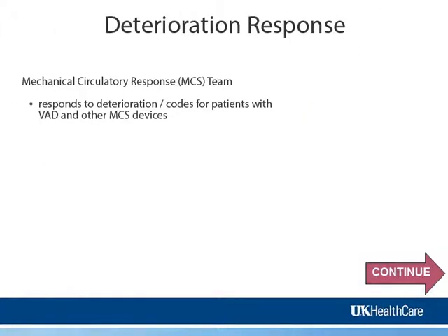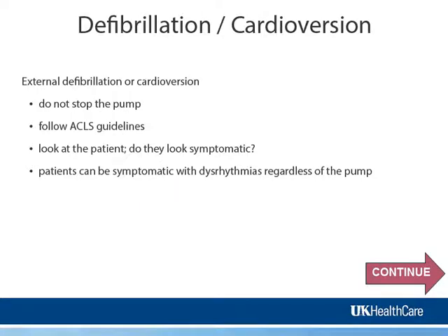Deterioration response. VAD patients may need specialty interventions when their condition changes. The MCS response team has been developed to meet those needs. Contact beeper 330-7671. If external defibrillation is necessary, leave the pump running.